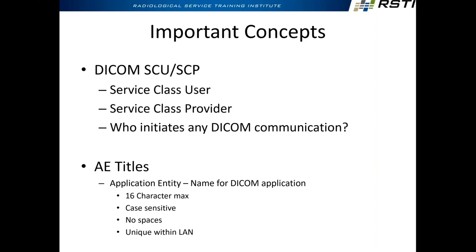You probably have heard of AE titles before, right? AE stands for application entity. It's part of the DICOM standard, which names the application entity. Application meaning software, right? The entity is like a device. So the AE title is basically just a software name for a device. There are some rules when you're assigning AE titles.